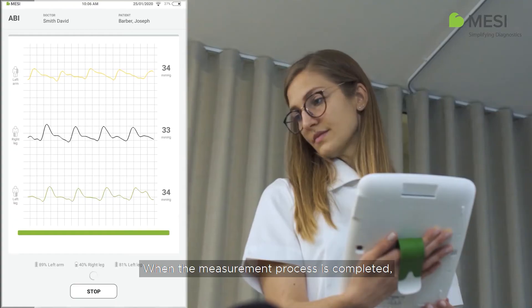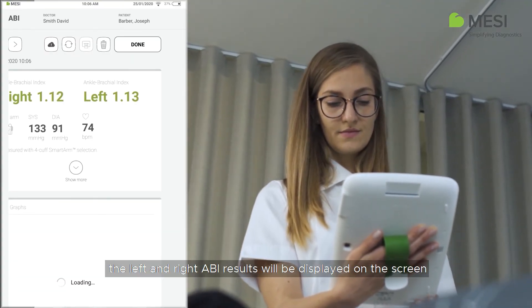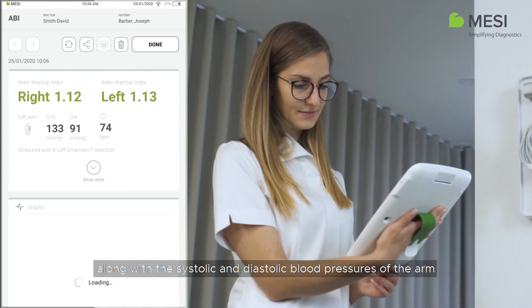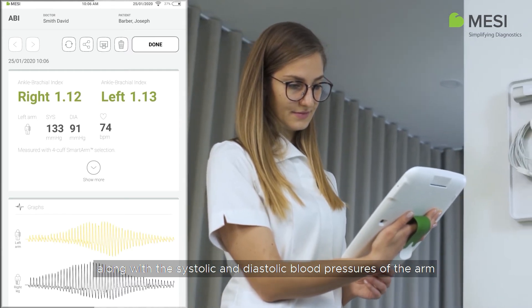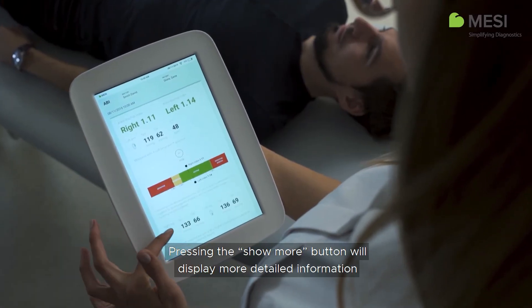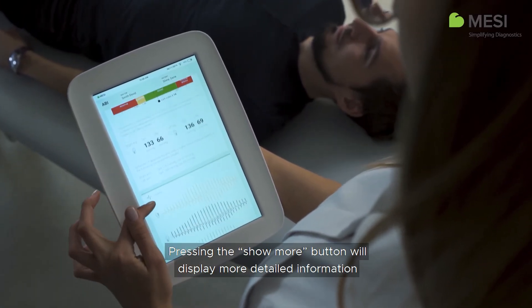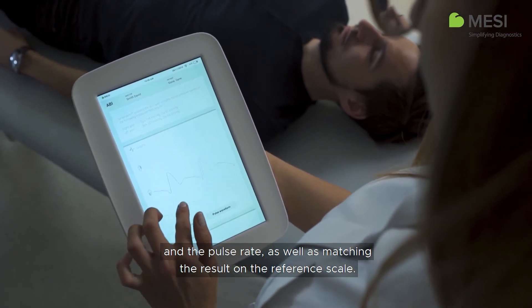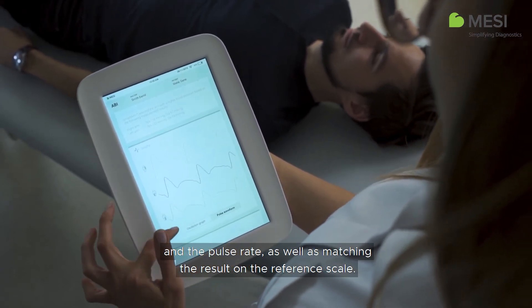When the measurement process is completed, the left and right ABI results will be displayed on the screen, along with the systolic and diastolic blood pressures of the arm that was used for the calculation. Pressing the Show More button will display more detailed information regarding the systolic and diastolic blood pressure measurement and the pulse rate, as well as matching the result on the reference scale.